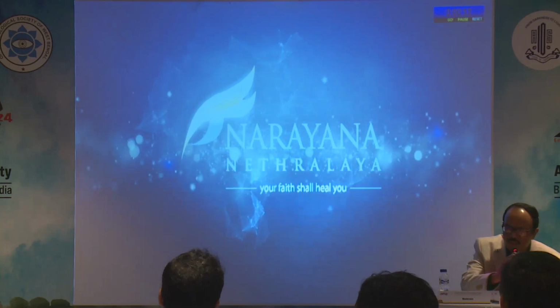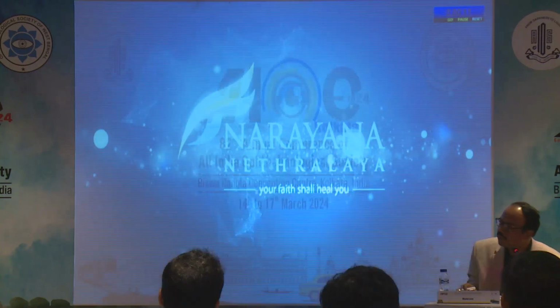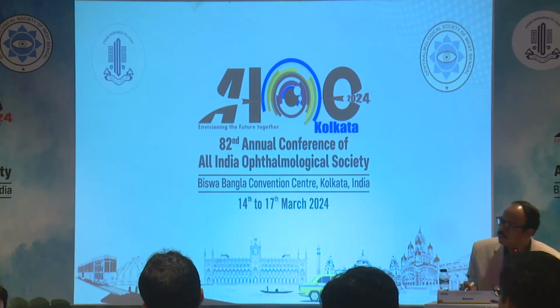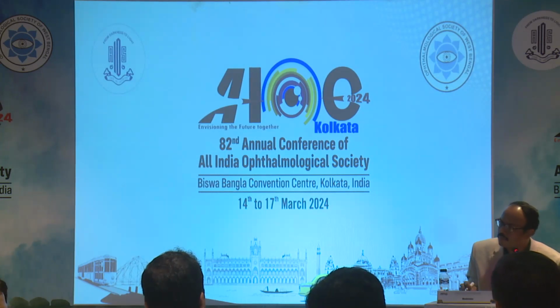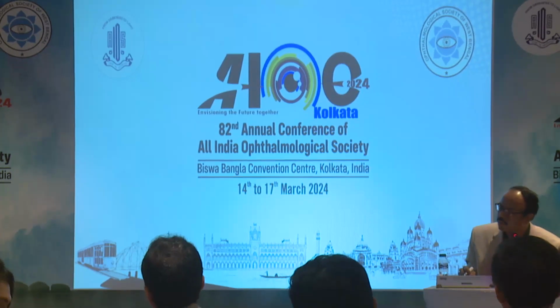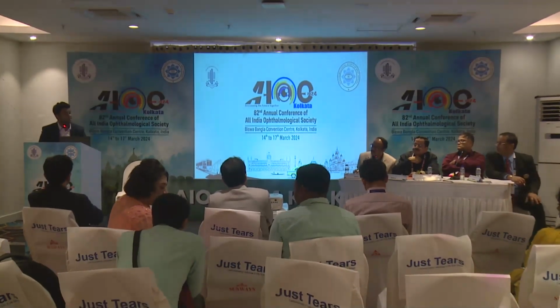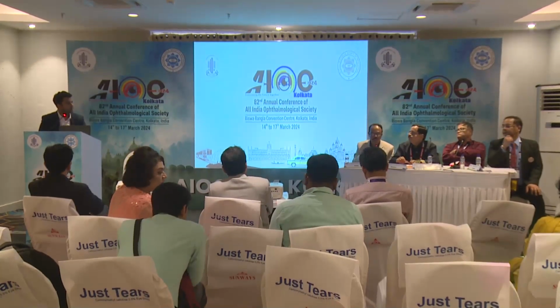What was the refractive status of these patients? Were they comparable? Yes, they were comparable in terms of refractive error and biometry. So in both studies, in both groups, we took patients where the biometry was comparable. The normal range of axial length and white-to-white was taken, and none of the extremes of myopia or hypermetropia were included, to have a more comparable result. The same lens was used in all patients.